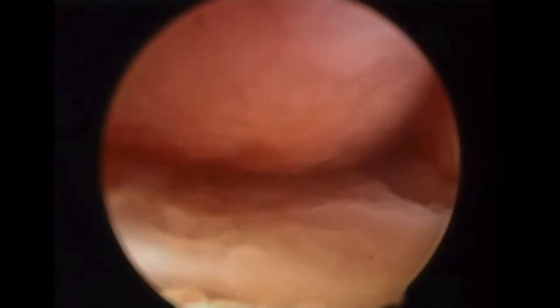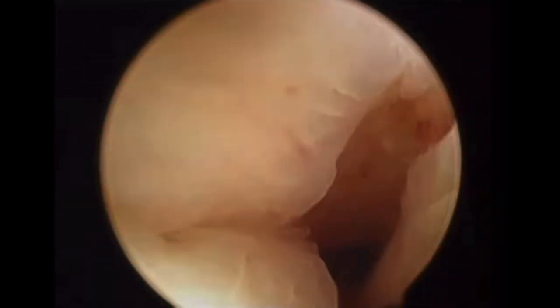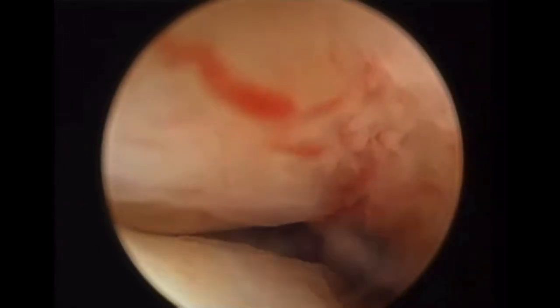Here in the cervical canal, take your time. If there is some blood, you should do irrigation and cleaning of this mucus and blood. Otherwise, you will be like driving your car with the front window covered by fog. You can see that the cavity has some blood and blood clots. Continuous irrigation and manipulating the fluid pressure to push a jet wash creates turbulence and cleans the content of the cavity.